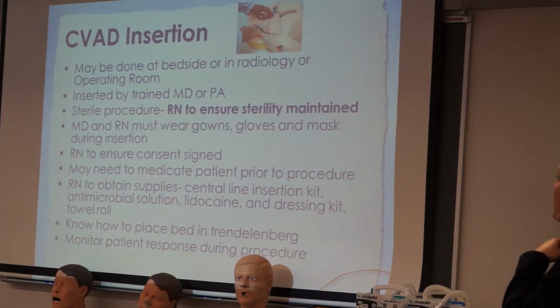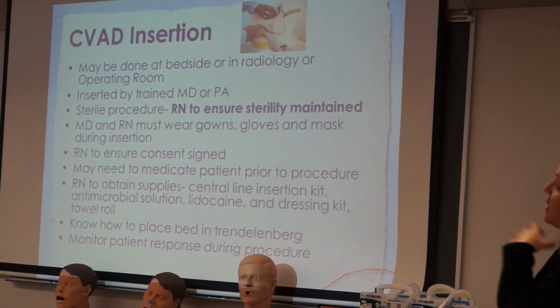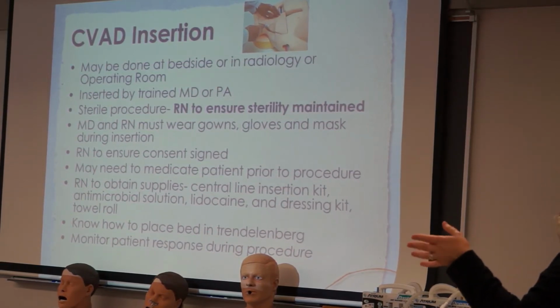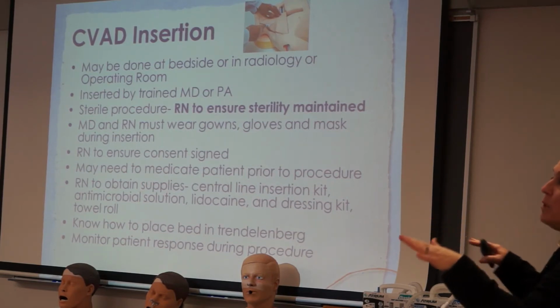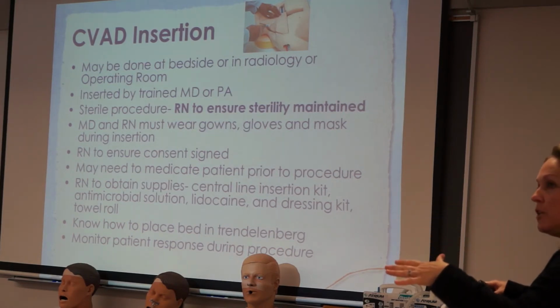They do have to be put in by trained doctors or physician assistants. It is a sterile procedure. And if the doctor is going to put in a central line at bedside, as the nurse, it's your responsibility to make sure that you keep everything sterile, that you recognize that everything in blue is sterile. You don't want to corrupt the sterile field. You don't want the patient to corrupt the sterile field.